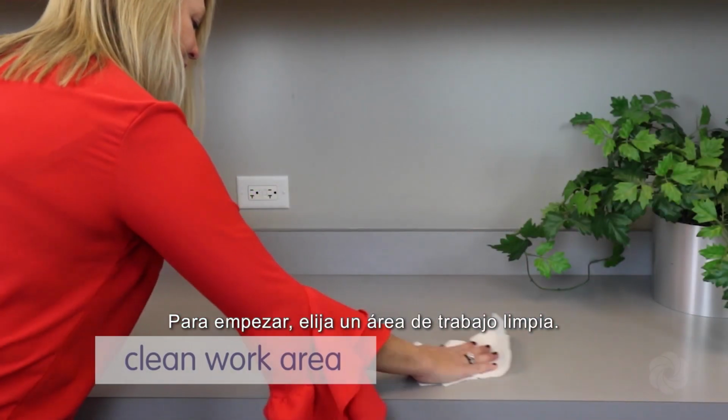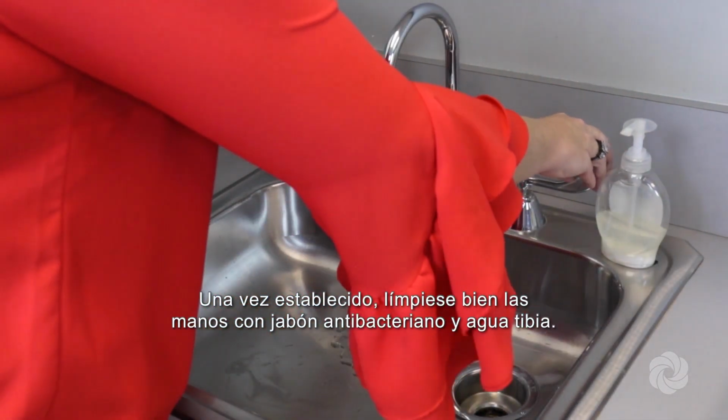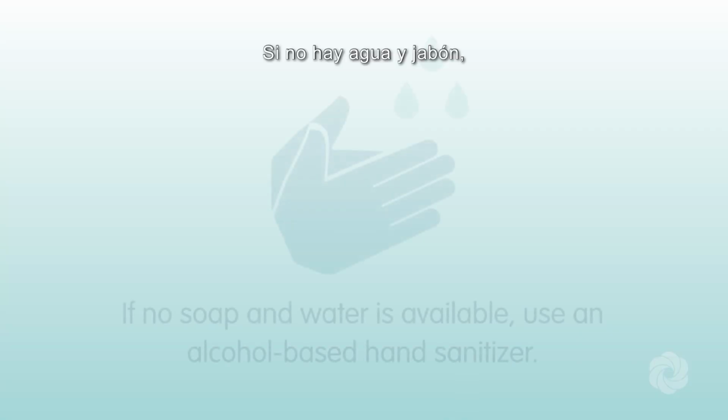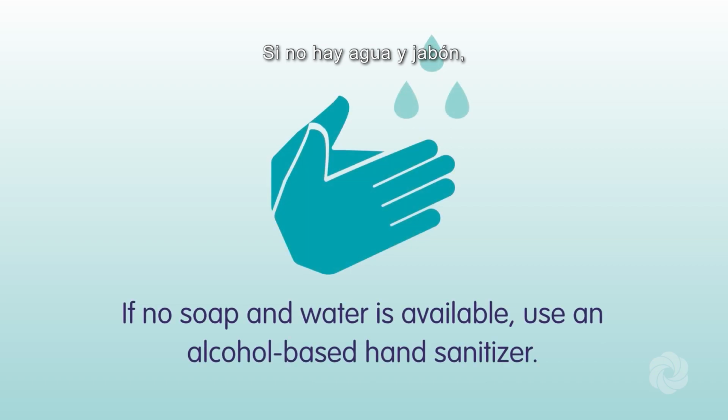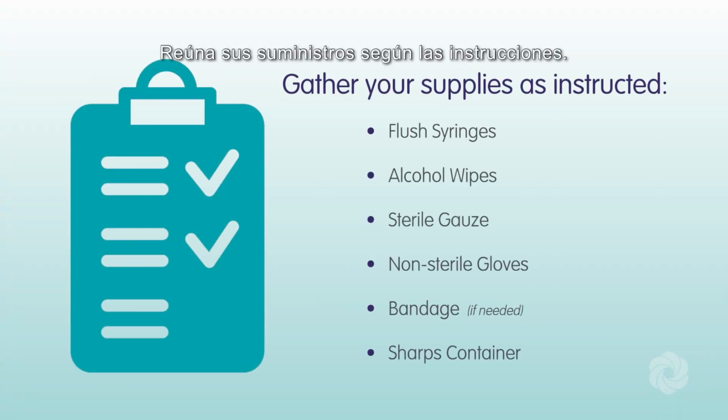To get started, select a clean work area. Once established, clean your hands thoroughly using antibacterial soap and warm water. If no soap and water is available, use an alcohol-based hand sanitizer, followed by drying your hands with a clean towel. Gather your supplies as instructed: flush syringes, alcohol wipes, sterile gauze, non-sterile gloves, bandage if needed, sharps container.